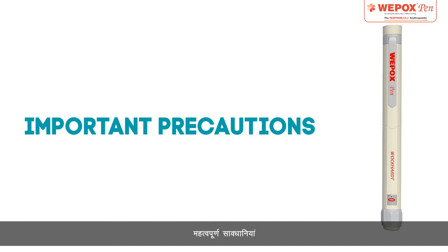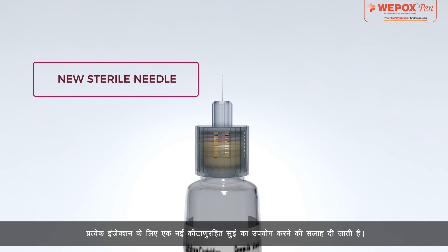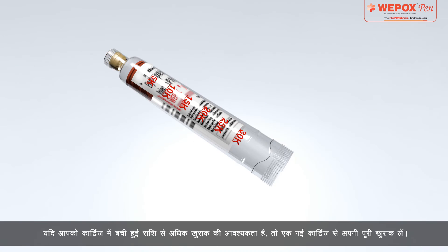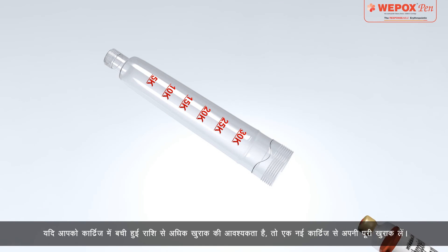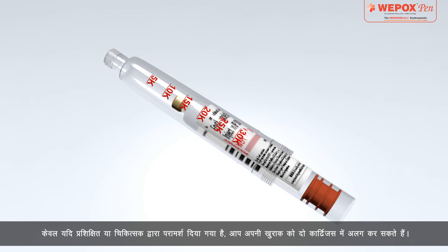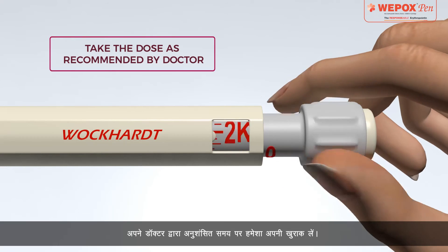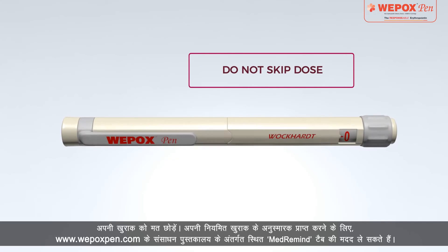Important Precautions: Always use a new sterile needle for every injection, and ensure the pen is primed with a drop of erythropoietin at the needle tip. If you need more dose than the amount left in the cartridge, take your full dose from a new cartridge. Only if trained or advised by your doctor may you split your dose between two cartridges. Always take your dose on time as recommended by your doctor. Do not skip your dose.